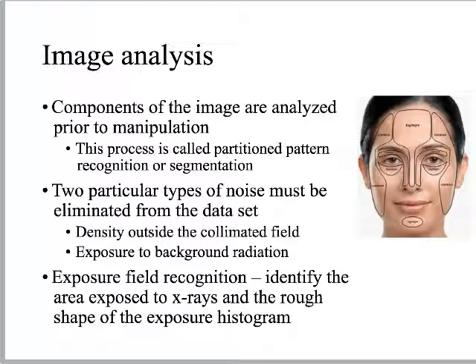The computer's doing a very similar thing when it does what's called histogram analysis. So we're going to use this image here on the right to help us understand these more complicated operations.